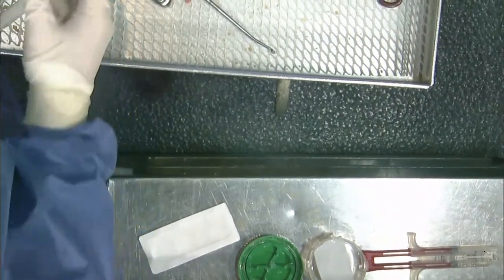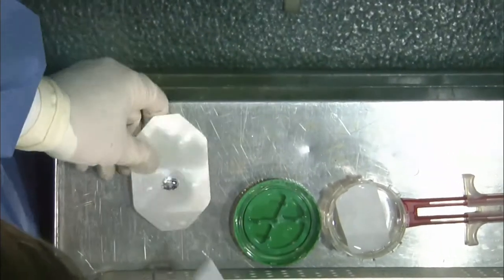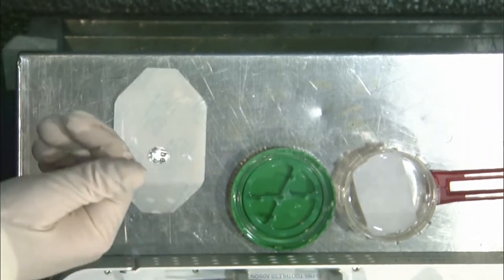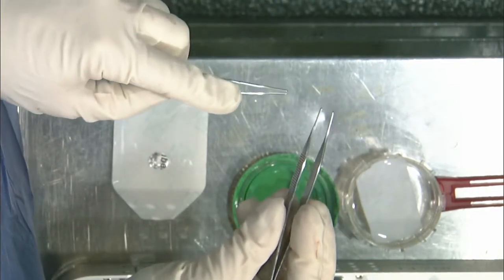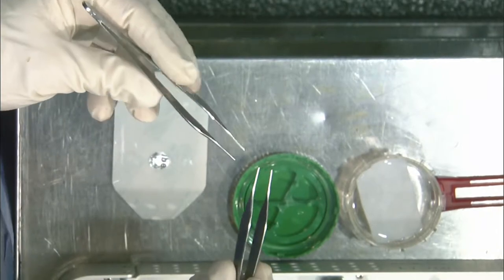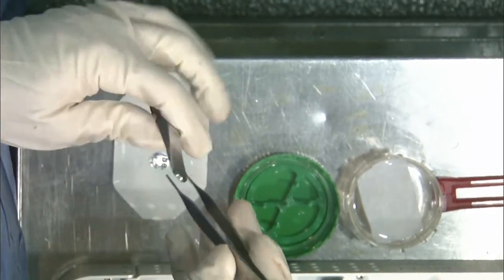So that way you're not trying to manage three different layers. Just two. Absolutely. So there's our implant with the writing up, again, the cell side up. These are basically flat pickups with no teeth. And again, this is something that you'll have all of this, but it's certainly something to make sure that your Vericel rep is bringing for you because pickups are all very different across centers.